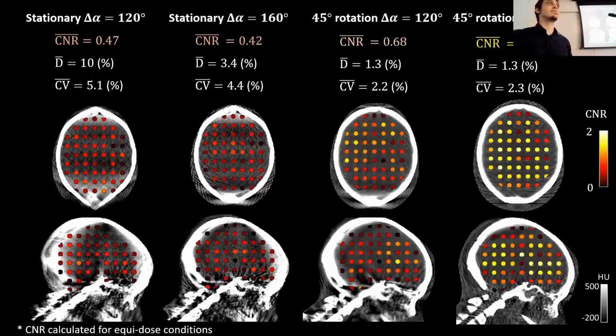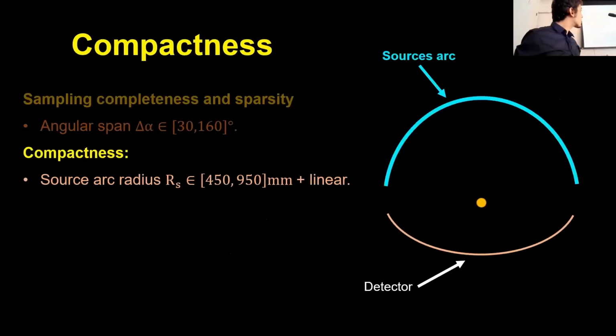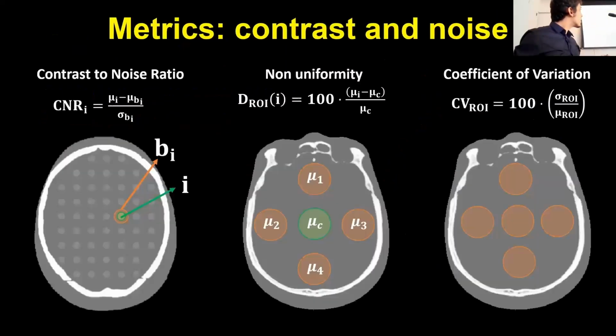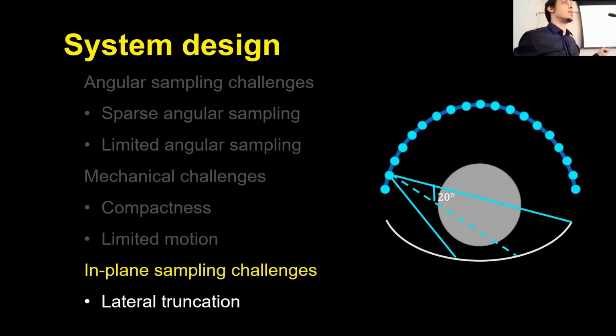Thank you. Nice talk. Have you thought about the angle of incidence on the detector? In some cases it's very far from perpendicular incidence on the detector. Is there a limit on what the angle of incidence can be? You mean this angle of incidence for the more oblique views? When the X-rays arrive at the detector, usually you like it to be perpendicular, right?